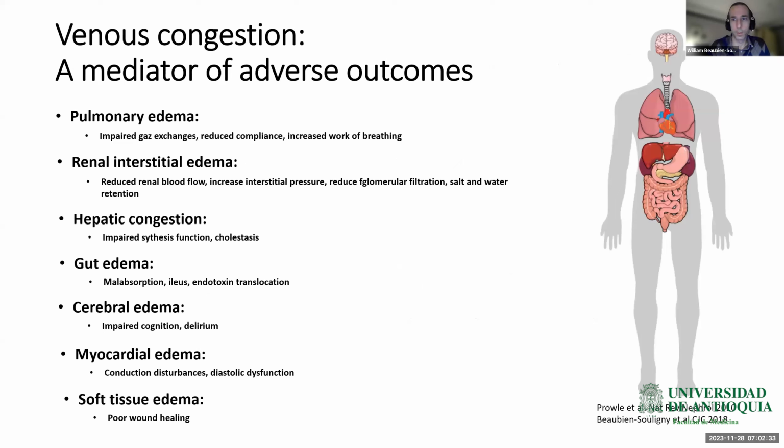If we only look at inpatients, this is another confirmatory study about intrarenal venous Doppler, which was published by Hussein Syed and colleagues, studying the patterns of intrarenal venous flow in more than 200 patients.